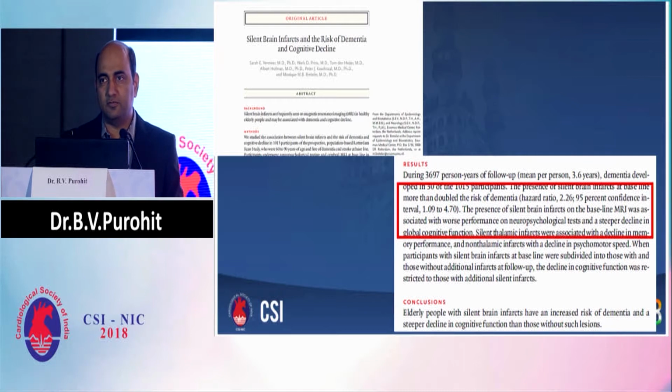So that is also something very important, because if a person who undergoes a TAVR procedure at the age of say 60, and over a period of time starts developing dementia and cognitive dysfunction, that is something which, if we can prevent it, there is nothing like it.